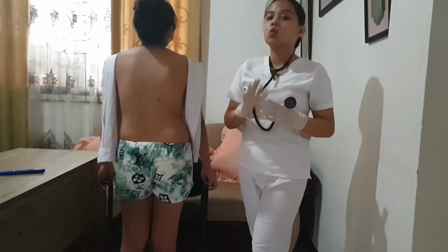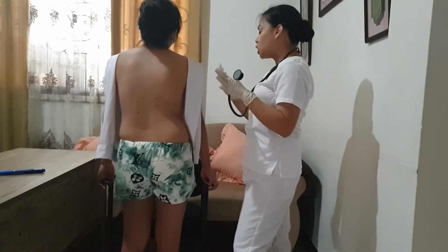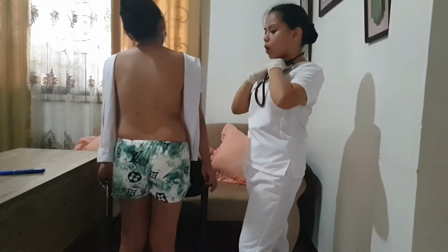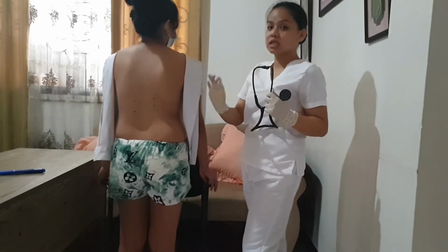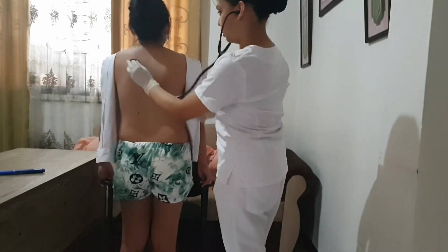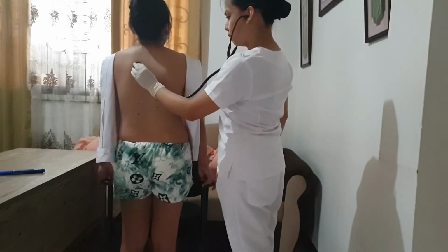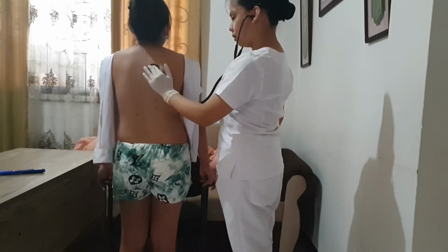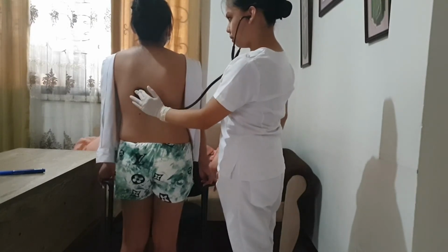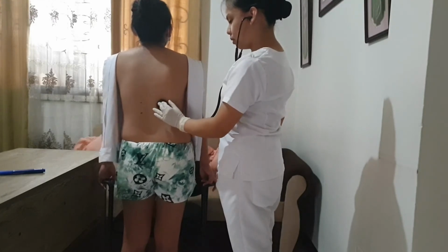The second one is called egophony. So for this one, you have to say letter E. You just have to say E, okay? Each time you feel the stethoscope, okay? The same procedure will be done. E, E, E, E.